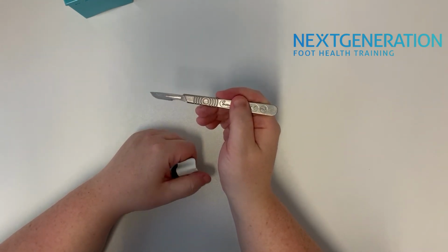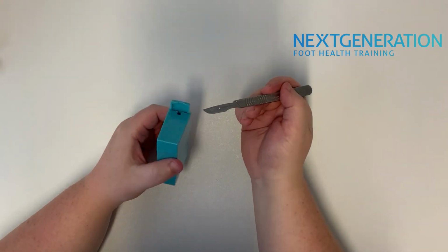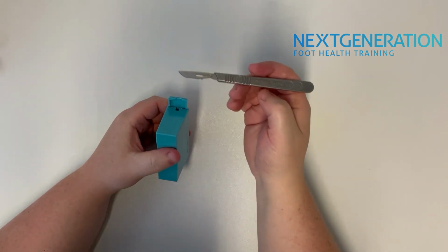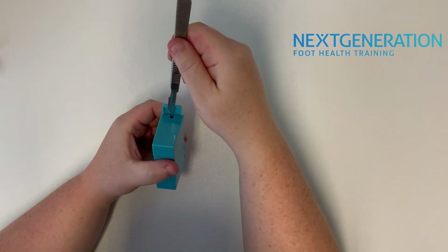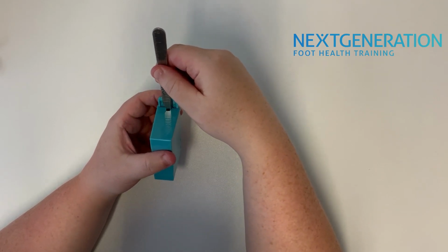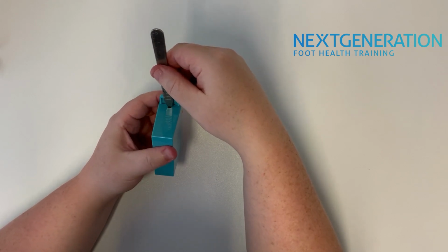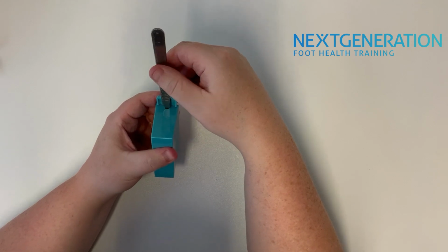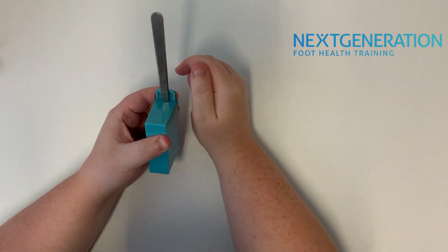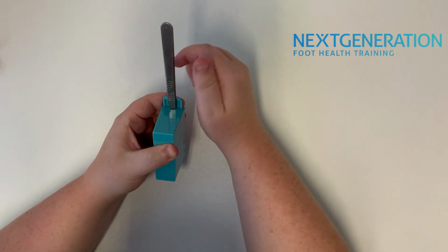It clips on. Obviously as soon as it clips on, you need to be very careful what you're doing with it. The blade box, holding it upside down, tilting it towards you. Measurement side facing up. Goes into the blade box, into the hole, finger towards the end with some pressure on, but remember we're not overexposing the skin. So pressure on at the end, gain a bit of pressure with the other fingers on top of the box like so. Handle piece is going in that direction, so we're actually pulling it away from us as well, which is a bit safer, and obviously we need to make sure we're away from our patients.